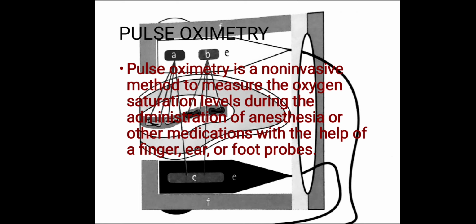Pulse oximetry. Pulse oximetry is a non-invasive method to measure the oxygen saturation levels during the administration of anesthesia or other medications with the help of finger, ear, or foot probes.